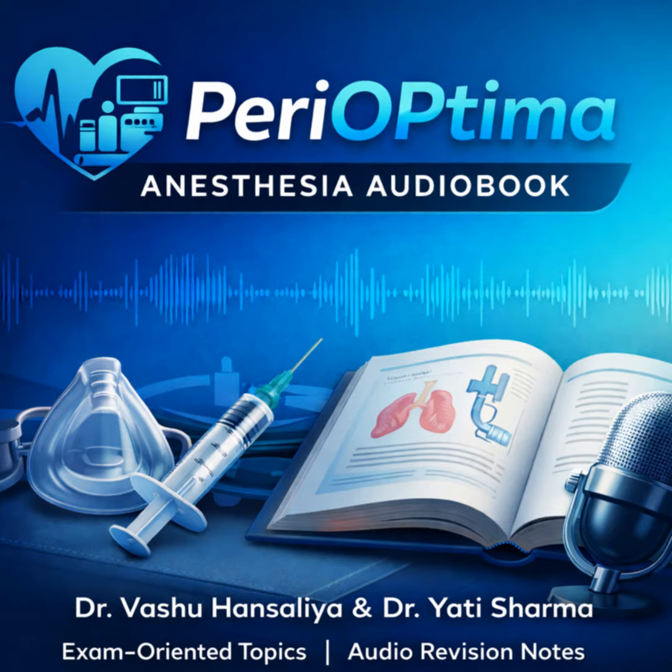And the third major component, the one with the dual function. That would be the working channel, or aspiration channel. It runs parallel to the fiber bundles inside the cord. And its functionality is pretty vast, right? Oh, it's huge. It allows for suctioning secretions, which is mandatory for your view. It lets you insufflate oxygen, which both helps with oxygenation and can physically blow away secretions from the lens. And as we'll get into, it's how you instill local anesthetic.